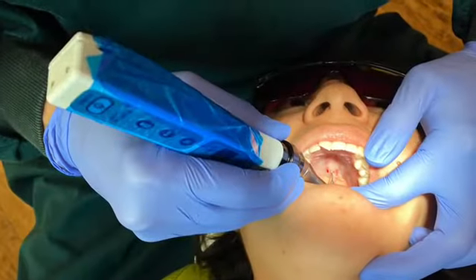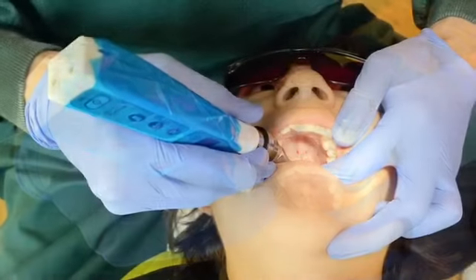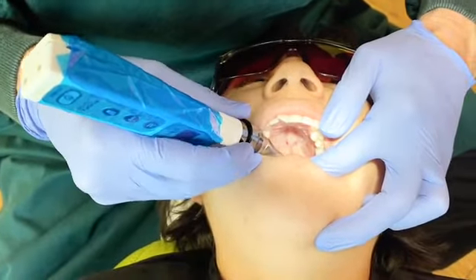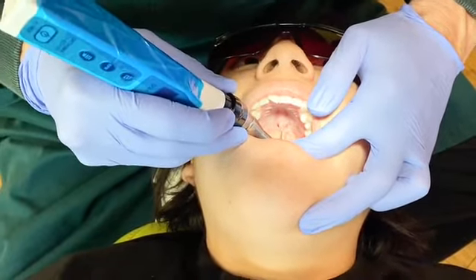This patient received corticopuncture treatment in addition to her MSE treatment. This treatment is not for all patients, but in this case was recommended by Dr. Ting due to her palatal tori, or thickening of the bone.